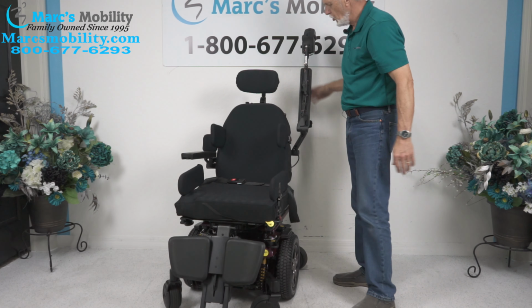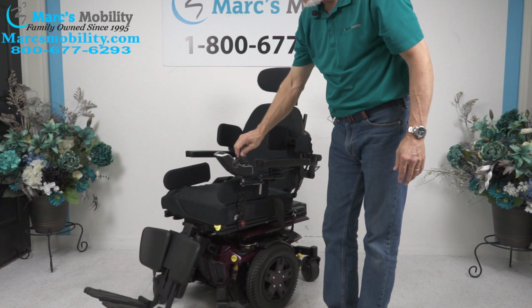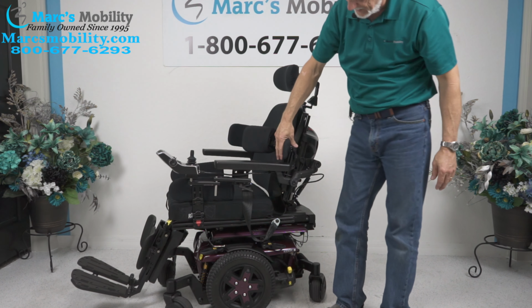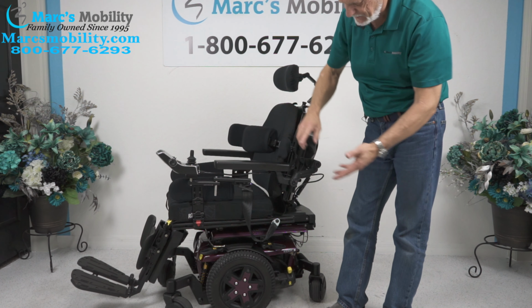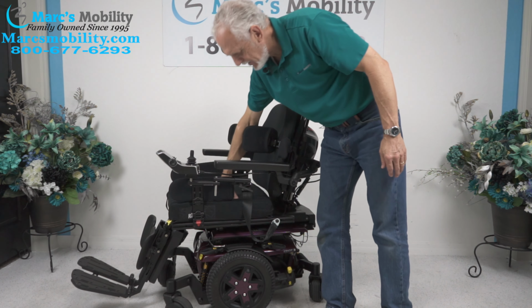Enjoy the rest. You also have on this chair elbow pads right here. So if you're tipping the chair all the way back, you have an elbow pad right here. You can see that it's all hooked up under the arm, and you have one on the opposite side also. So you have lateral pads, chest pads, elbow pads, air cushion.